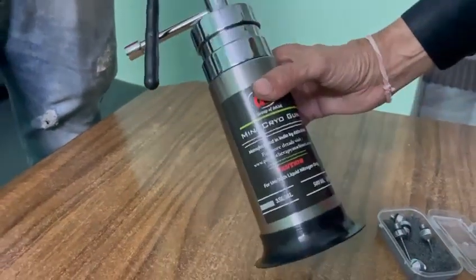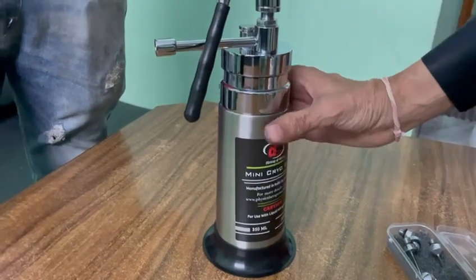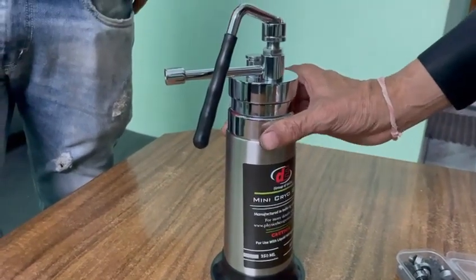This is the Delta Mini Cryo Gun, available in 350 ml. We also have another model in 500 ml.